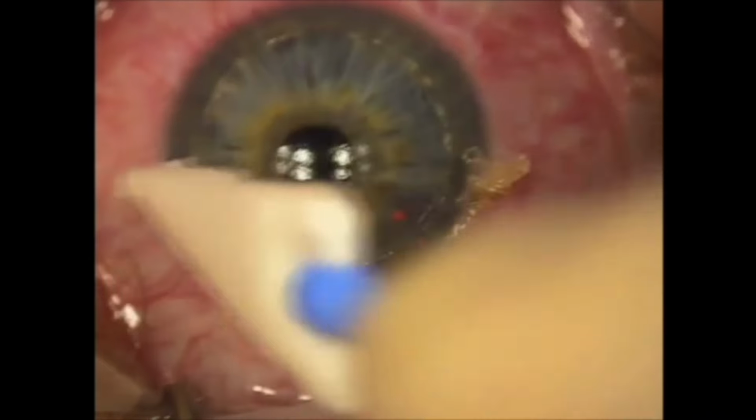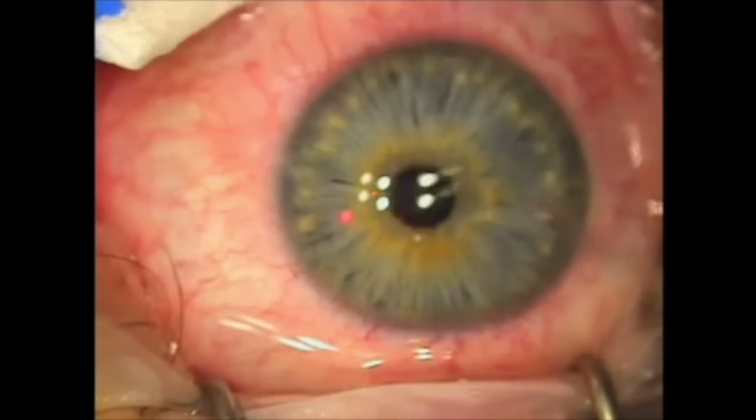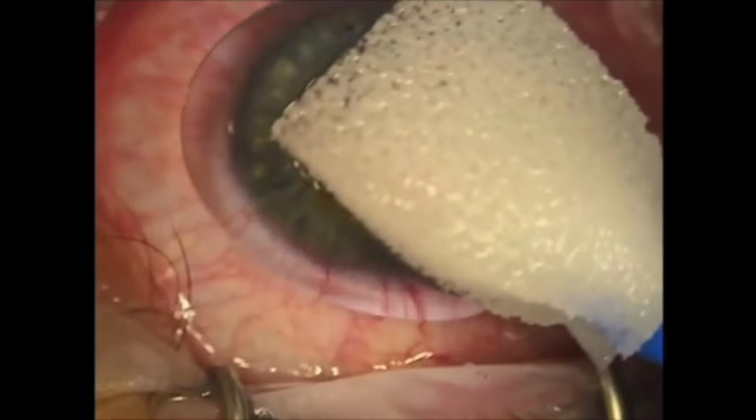Now we'll have the patient fixate and apply the proper tracking with the excimer laser, and then apply the excimer laser. You can see the spherical correction here, now the cylindrical correction, and we'll then apply mitomycin C 0.02% for 12 seconds, and then very vigorous irrigation and a bandaged soft contact lens.